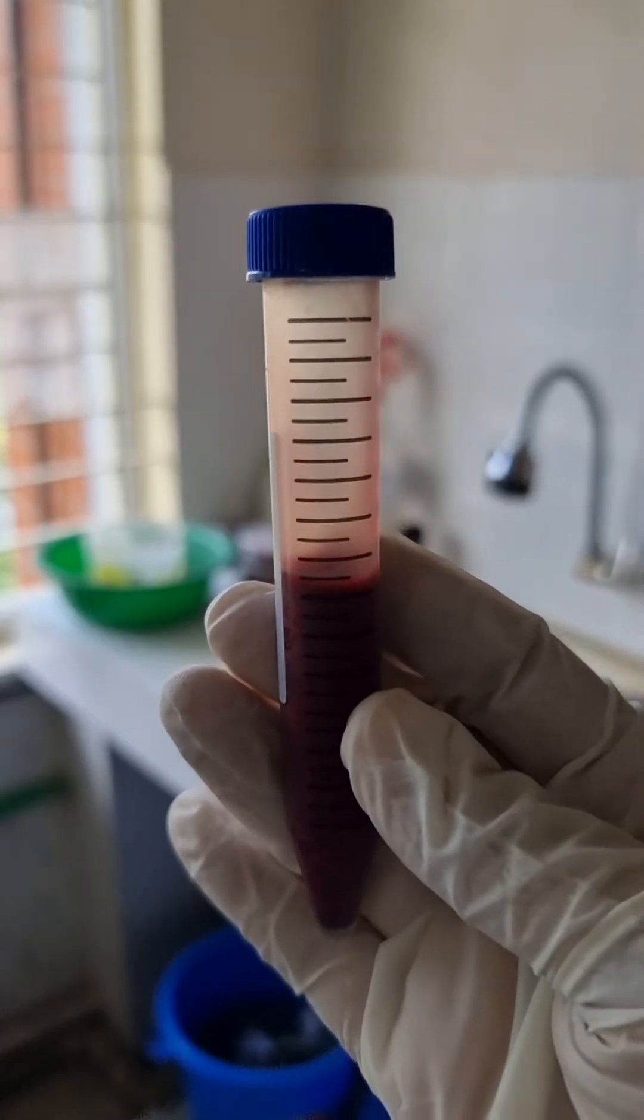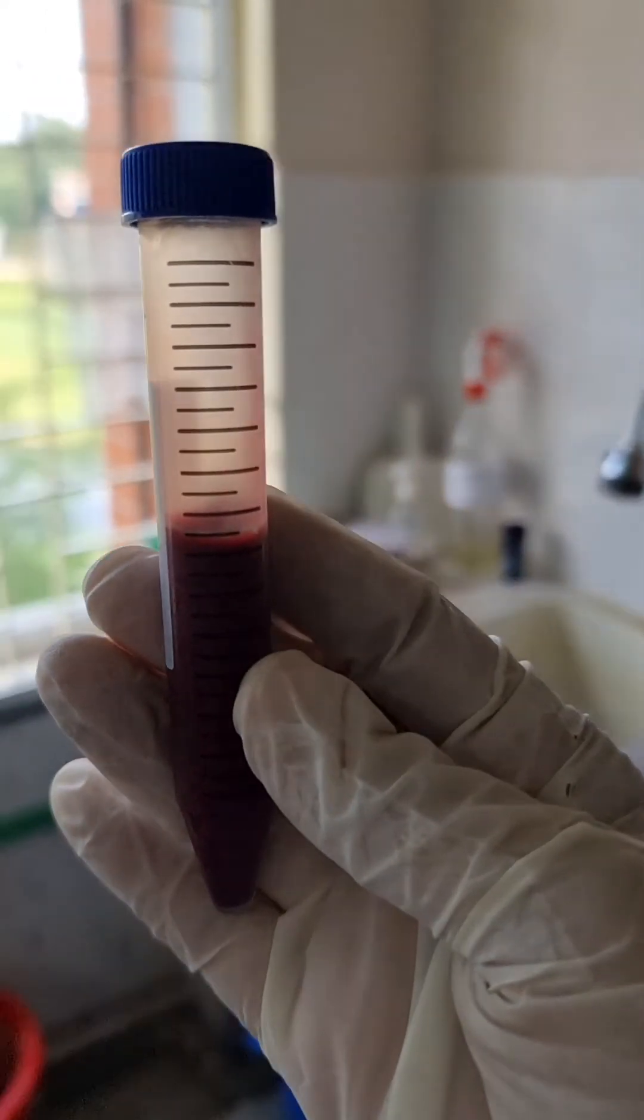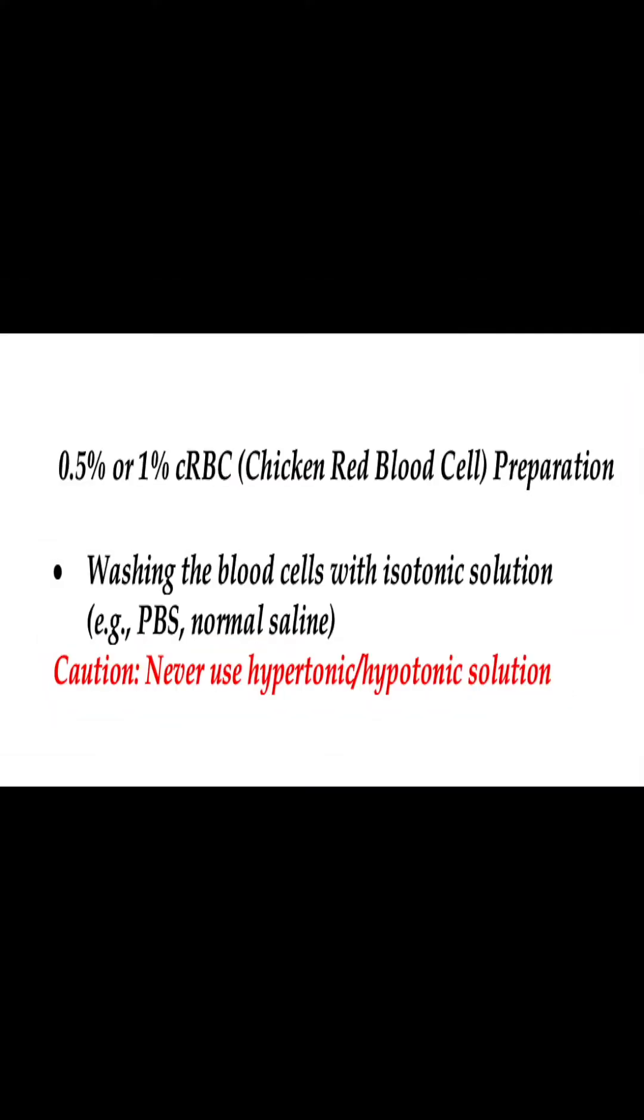First of all, we have to make 0.5 percent chicken RBC from the collected blood. The procedure starts by washing the RBC three times with phosphate buffer solution or any other isotonic solution.